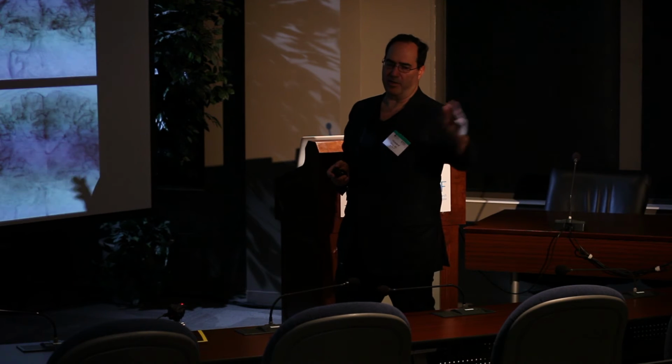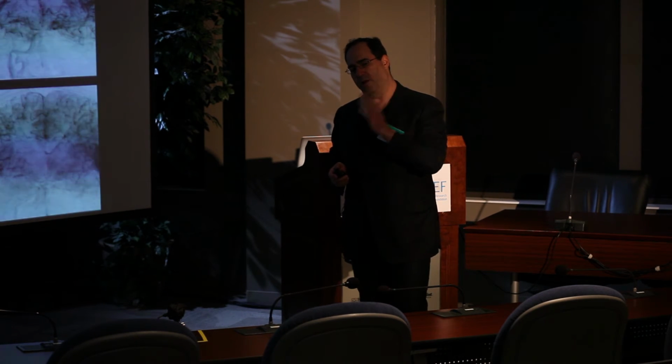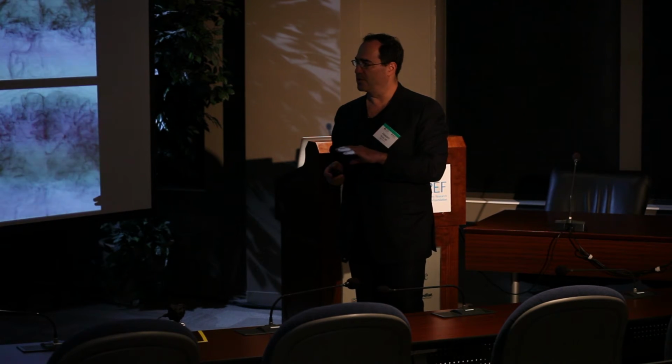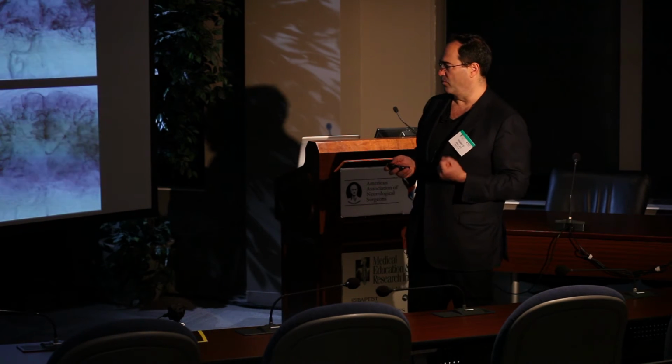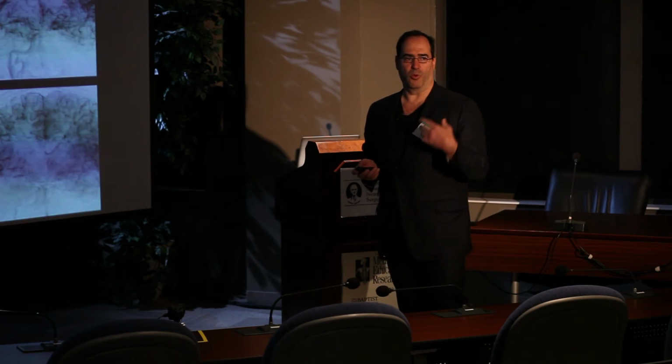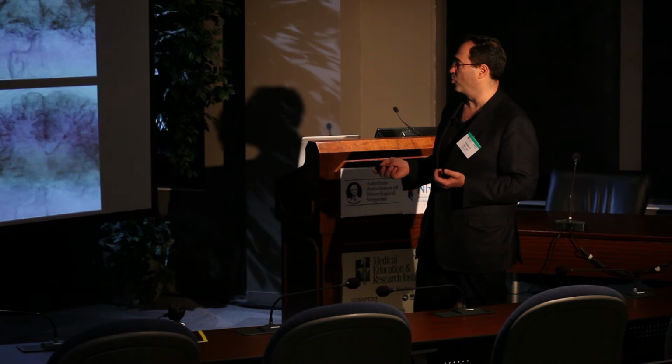So you want to see how things flow, particularly when you start treating AVMs. You want to see how blood moves through these things. You take advantage of the dynamic nature of this study so that you can understand flow. And that's a really, really useful tool, but something that you won't pick up on until you've done angiography for a long period of time.